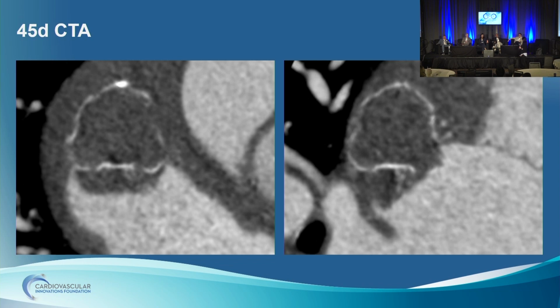And how many people would do additional imaging? I don't think there's anything wrong with getting a TEE, but I think you have the information here based on the CT. And if you want to see mobility, you can acquire images across the entire phase and stack those images and play them. You see a very irregular hypoattenuated lesion on the atrial side of the device, and that's a DRT. But most of these that I have seen, the clot on the surface of a device reminds me of when unsavory people use chewing gum and stick it on a table. It's more like a solid mass sitting there. I have never seen it highly mobile, but I might be wrong. Yeah, I have seen case reports of more pedunculated types of thrombus. This one we thought looked more like, as you said, a piece of gum stuck onto it.